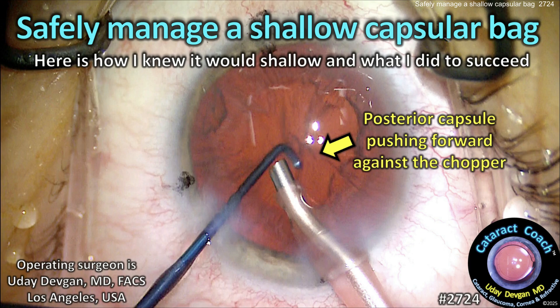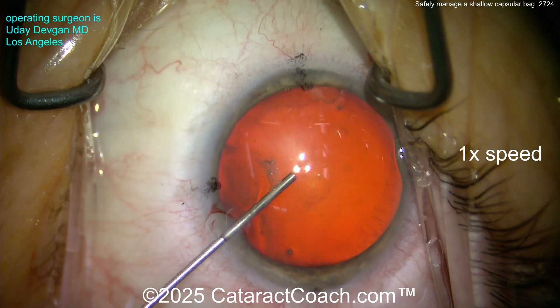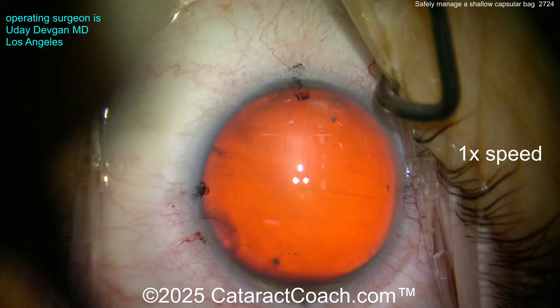CataractCoach.com — how to safely manage a shallow capsular bag. Here's how I knew it would be shallow and what I did to succeed. This is me operating. Let's cut through it and start with this case. Put the viscoelastic in — all looks pretty normal, good dilation, not too dense of a cataract.